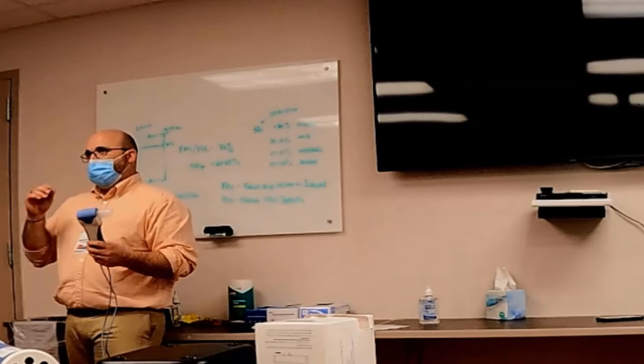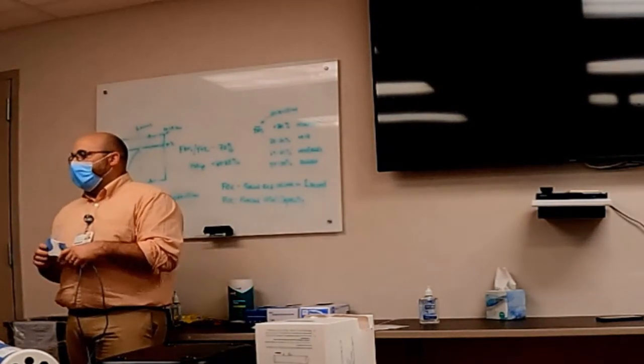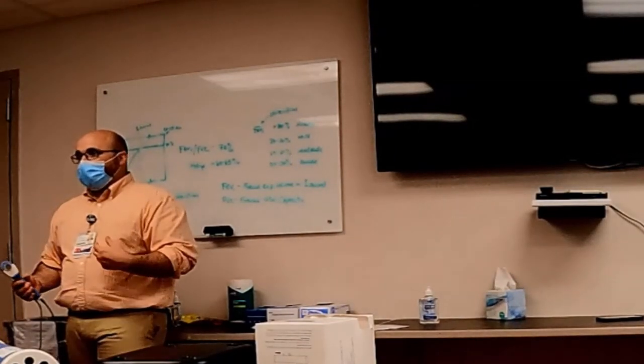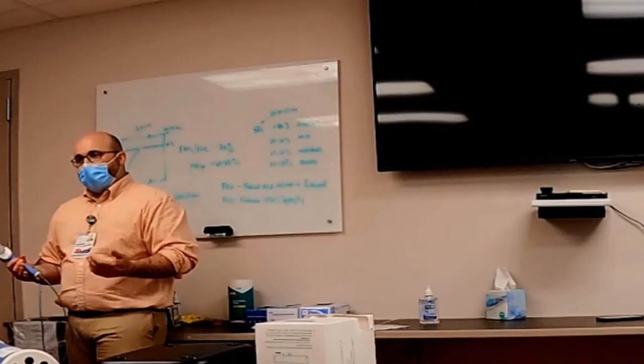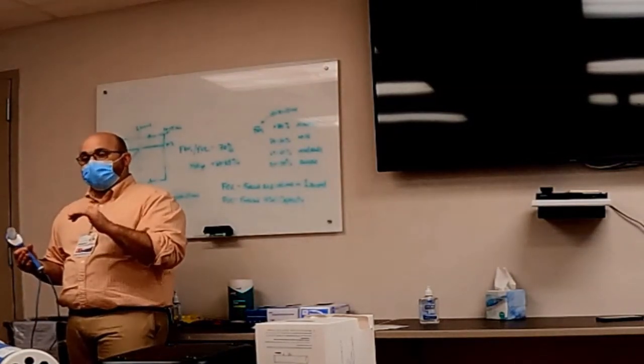they may have, I call it, juiced. They may have a little higher numbers than what they should. Just document that. If they took their albuterol inhaler on the way in today, just document that albuterol inhaler on the way in, just so that you know. So if we look at it last year compared to this year, we know that they took their albuterol inhaler, so it's a little lower. Maybe that's the reason.